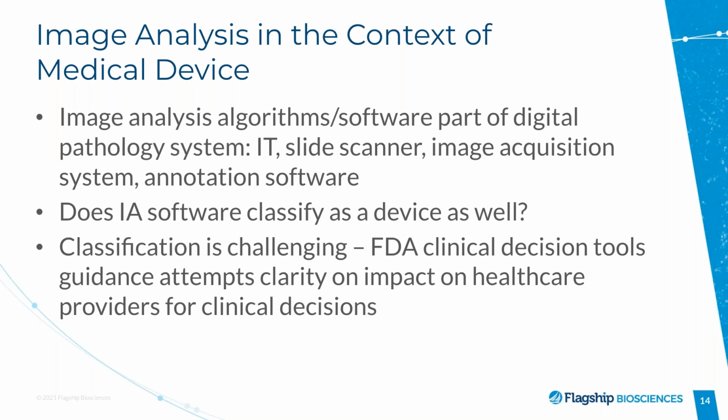Thanks, Roberto. Another key point here is that a lot of times within the context of clinical trials, you're getting very limited tissue due to the impact to the patient. But that's where image analysis can really help to support and drive some of these large data sets by squeezing as much data as possible out of these very small sample sets, and being able to integrate pathology support into that IA tool is critical here. David, I'd be curious to hear your thoughts on the clinician impact around this.